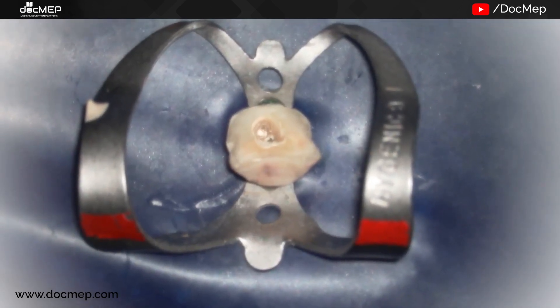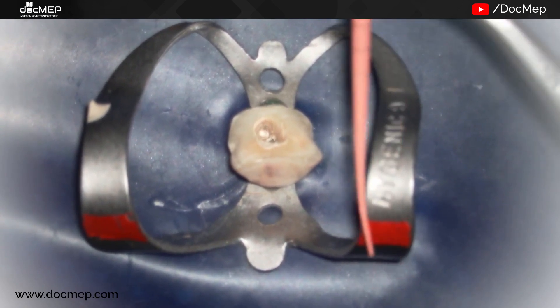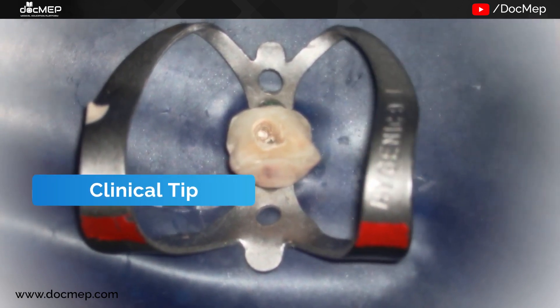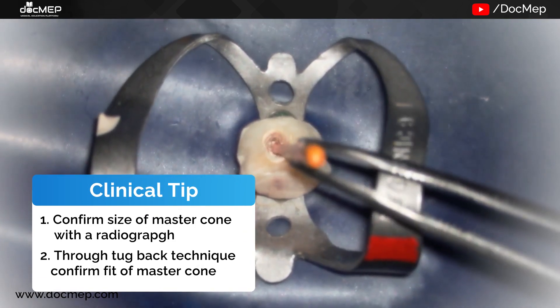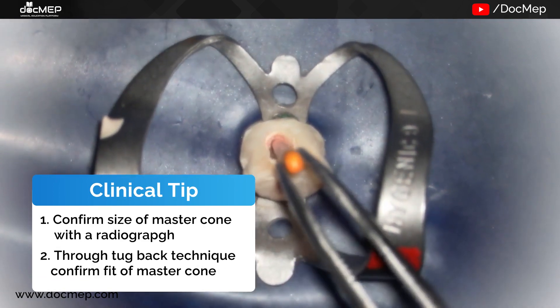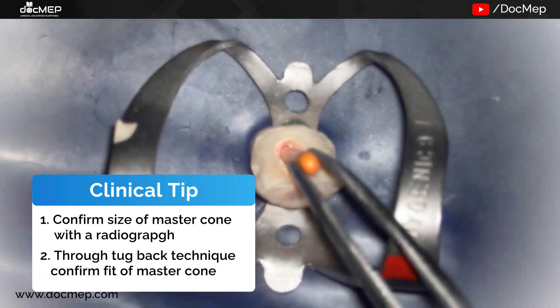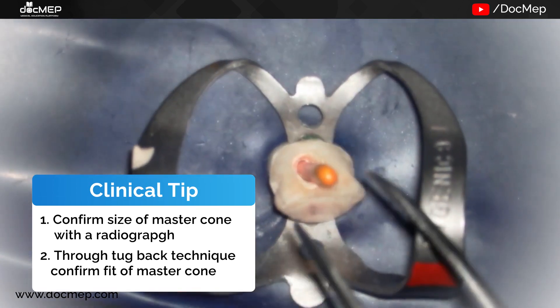Next comes our master cone, whose fit we had verified at the time of the master cone radiograph. At the same time, we had checked for the tuck back to get the exact fit. We place it in the canal and push it right till the working length.